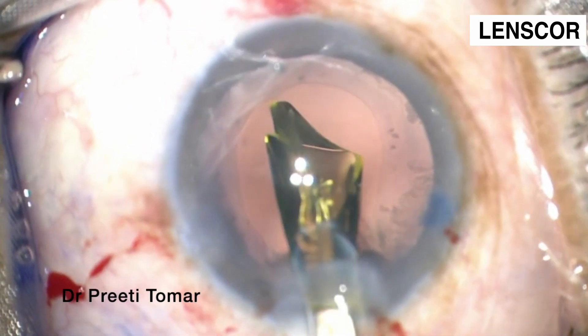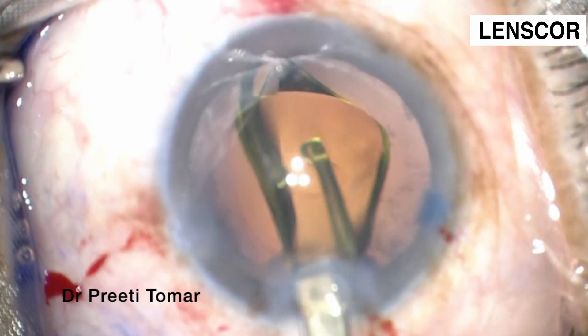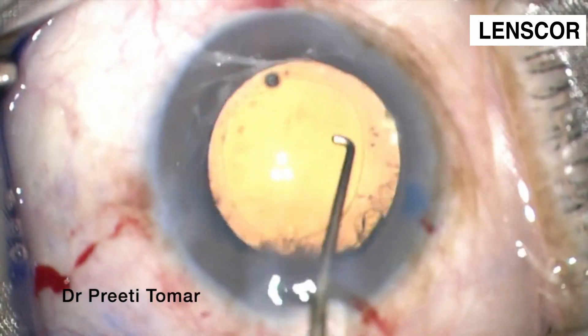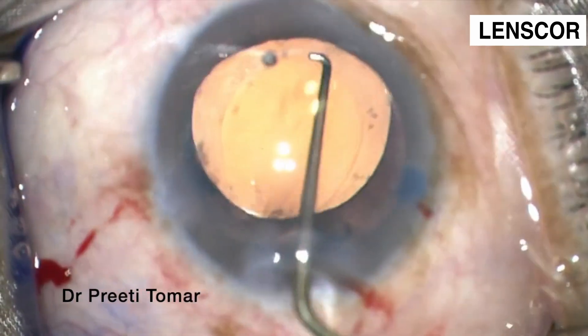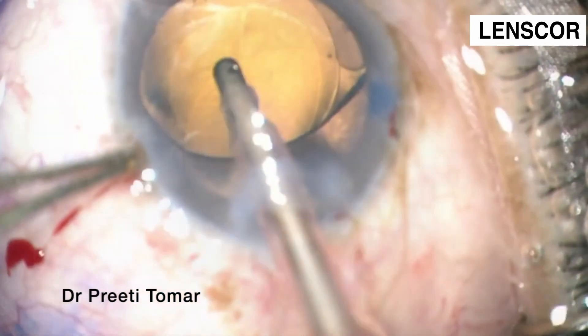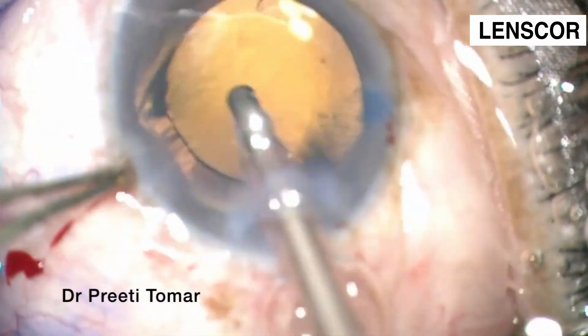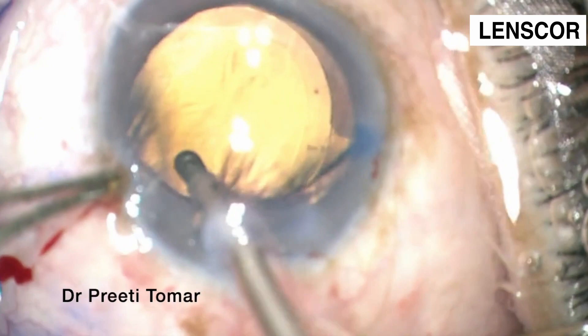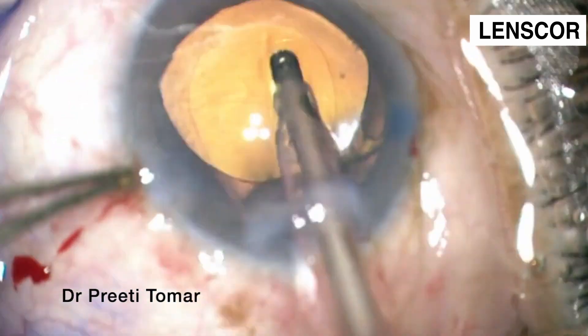Now intraocular lens implantation. We have used an acrylic monofocal lens. Then we proceed to visco removal with high vacuum and high aspiration flow rate.